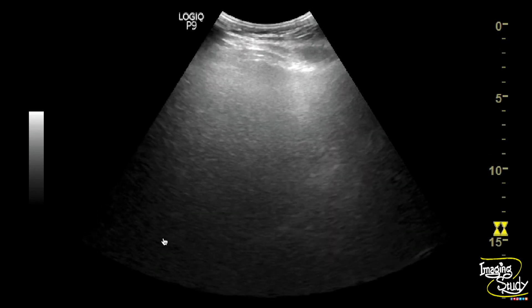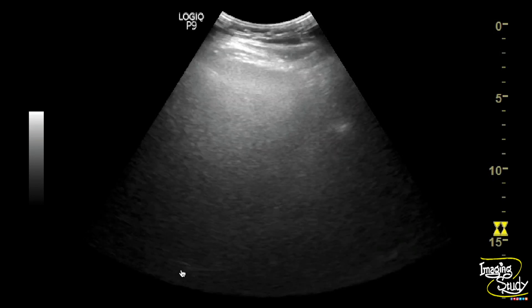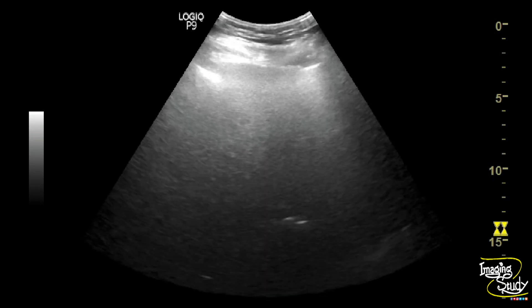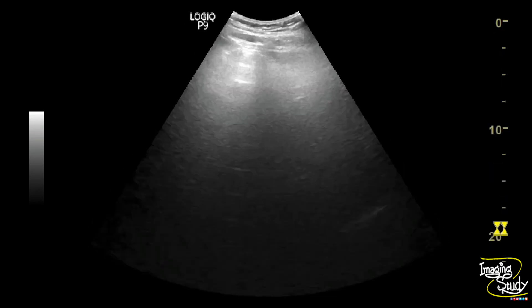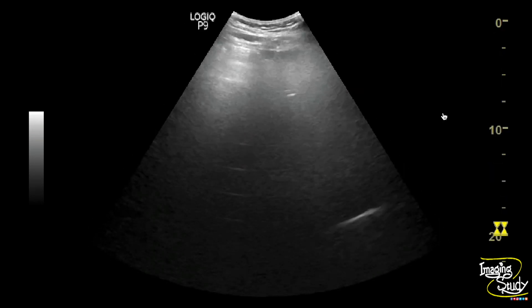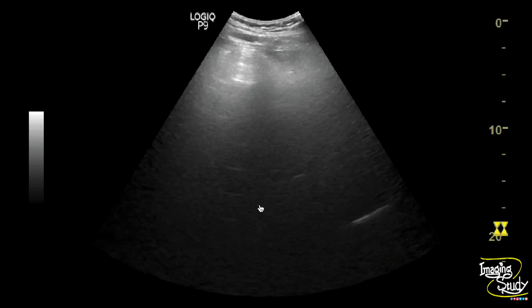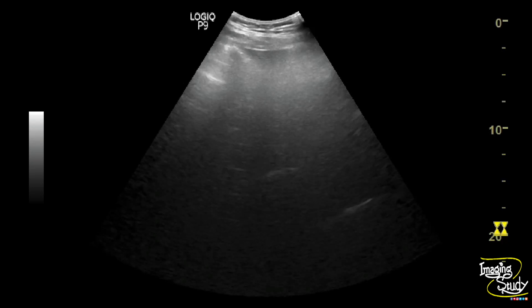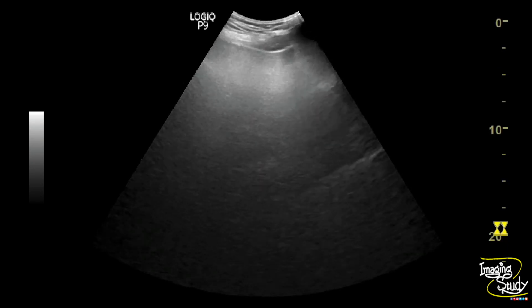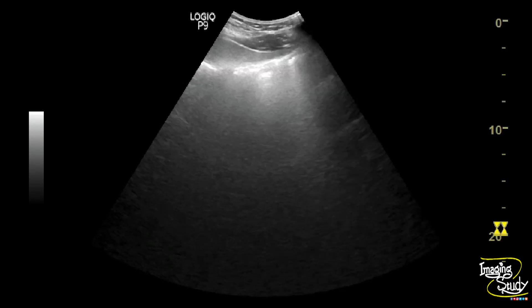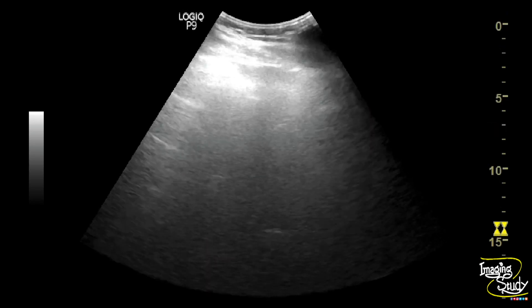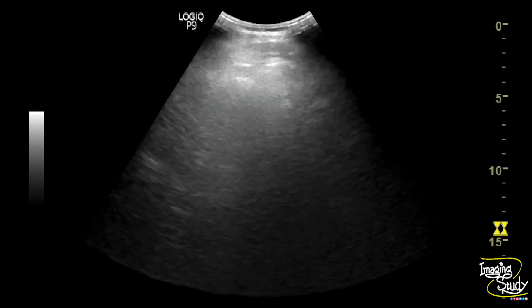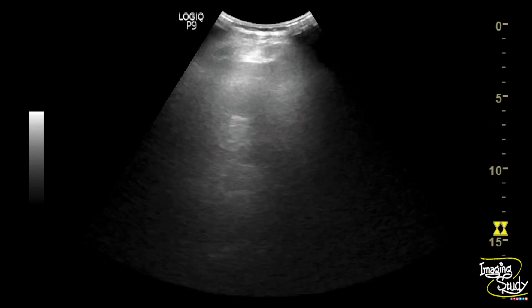This is the area for the diaphragm, but you can't see the diaphragm quite well. This overall grossly increased echogenicity of the hepatic parenchyma with non-visualization of vessels and diaphragm indicates this as a case of severe hepatic steatosis.